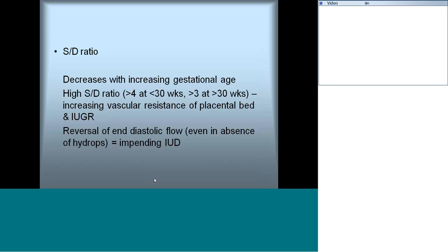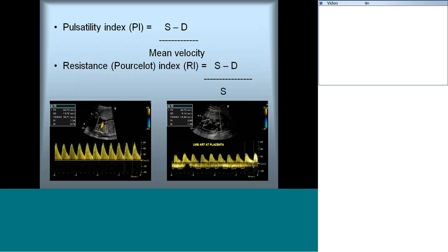Reversal of diastolic flow in the umbilical artery indicates impending intrauterine demise and can also occur in hydrops with significant back pressure changes. Normograms are available for umbilical artery Doppler and should be reviewed carefully.